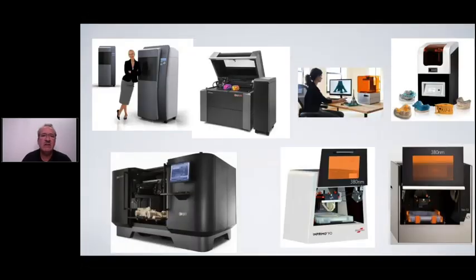Let me go for some industrial printers, something which I can use in the dental field. So I was looking around, what is on the market? You have huge machines like you see on the left-hand side, Objet machines and everything. I said, this is not interesting for me. Then I was looking at the Formlabs type machines. I said, this is not interesting because we want something really for the dental field, something also in the accuracy. Then the Bego machines, all these machines, they were not really the answer.